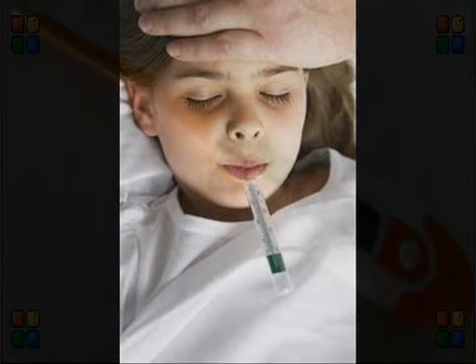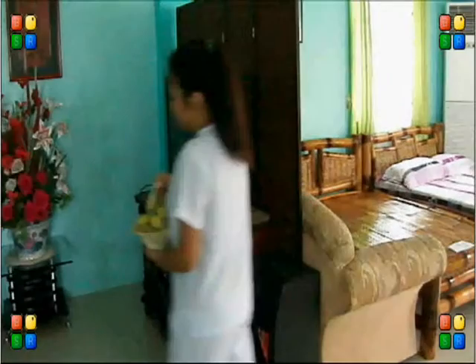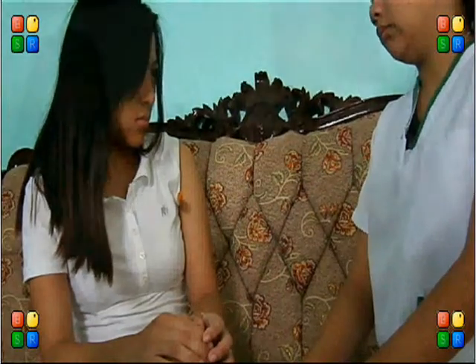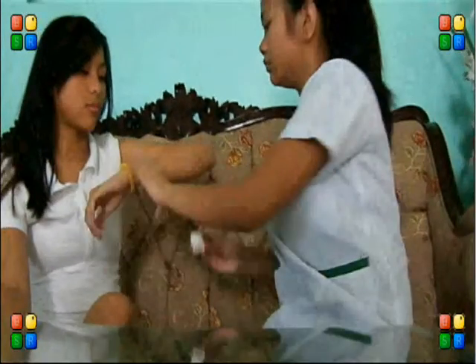If it goes above 37.5 degrees Celsius, this indicates a fever. Have the patient rest with the opposite shoulder raised, keeping the arm close to the side to enclose the thermometer and prevent contact with clothing. Leave it in place in the armpit, using a soft dry wash cloth or absorbent cotton to remove moisture.